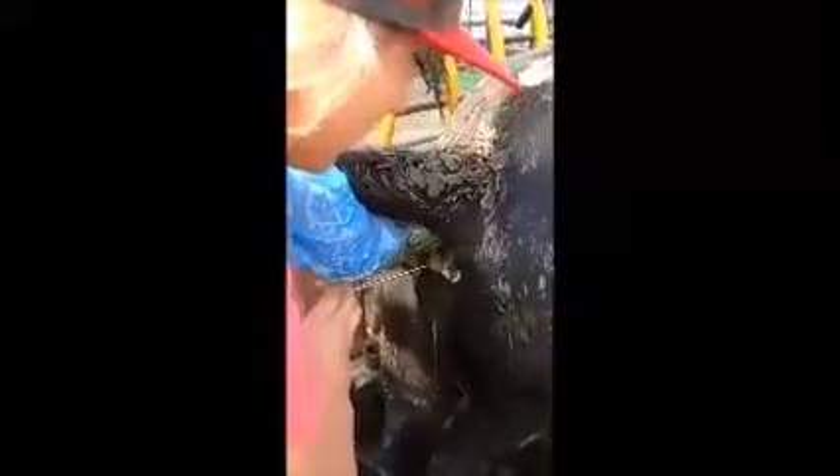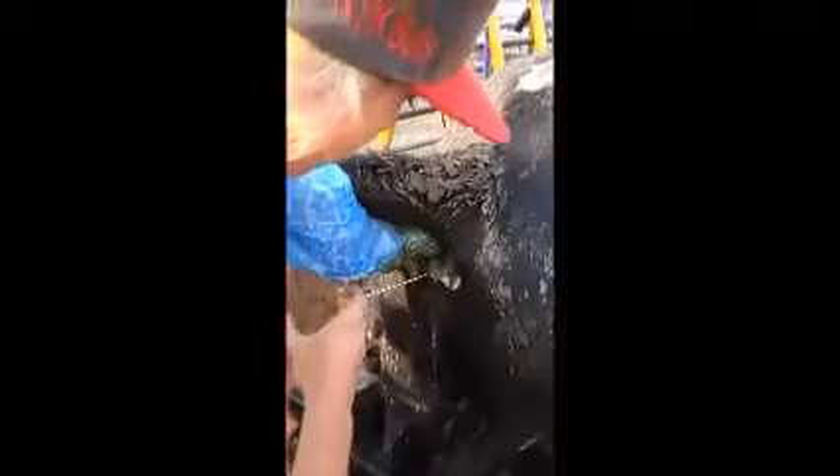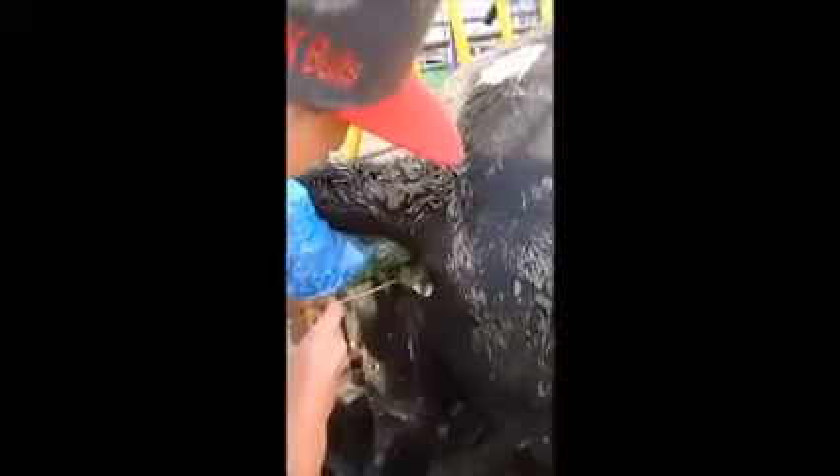And once you get it in there you deposit it right at the end of the cervix and you deposit it for seven seconds. And then you say a little prayer and hope she's pregnant. And that's how you breed a cow.